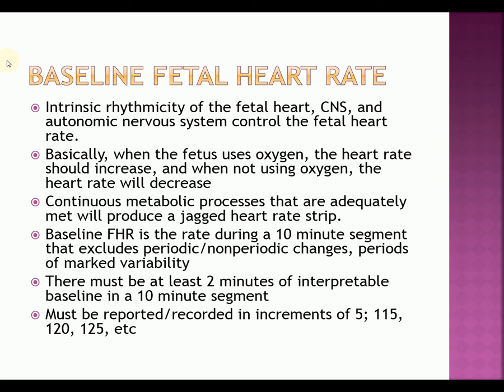We have to have at least 2 minutes of interpretable baseline data in that 10-minute segment in order to determine that baseline. So we take a 10-minute window on our fetal monitor strip, and out of that window, we've got to come up with at least 2 minutes where there isn't anything occurring, such as an acceleration or a deceleration.